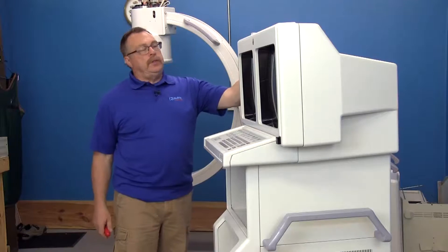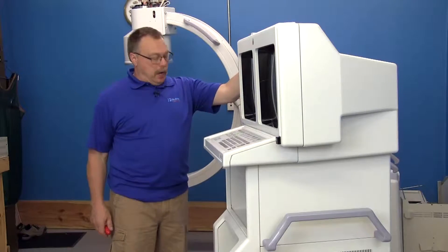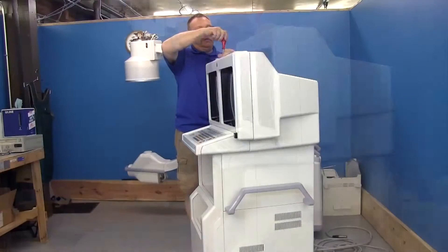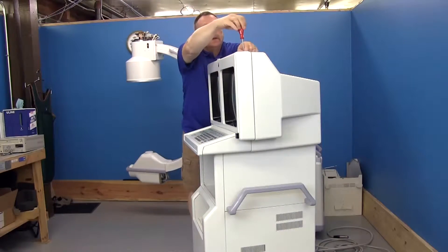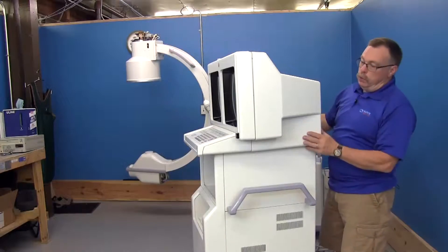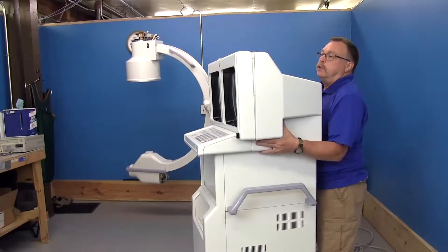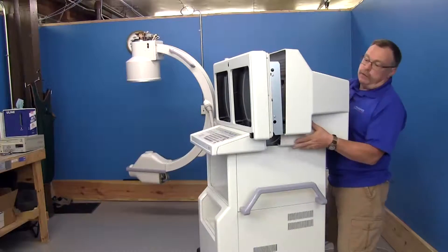First thing we want to do is take this hood back cover off. There are two screws on the very top here. There are also two latches on the bottom — just get a firm grip and pull it straight off.